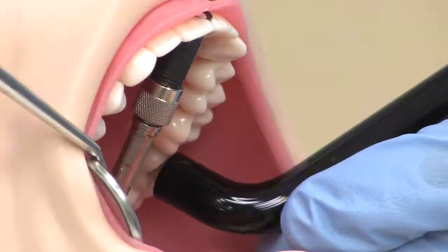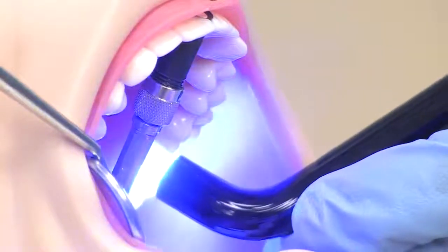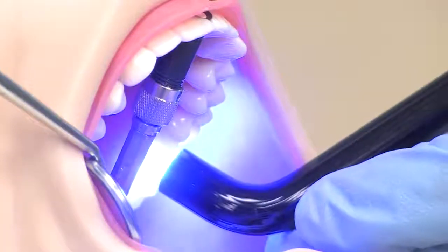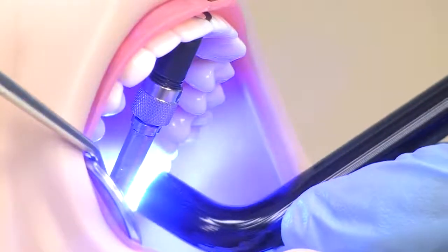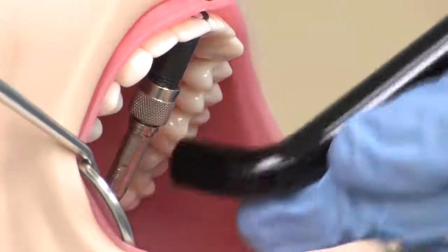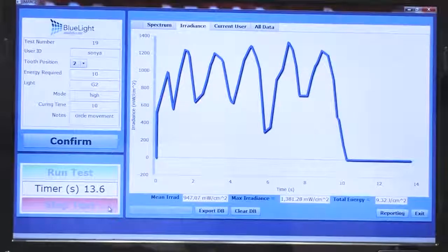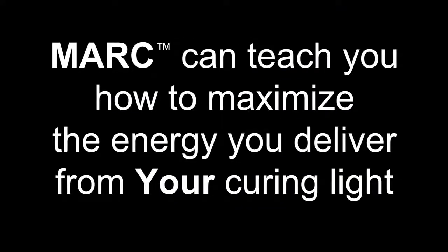Here you can see Mark being used to measure the amount of energy delivered to a simulated resin restoration during light curing. You will see the effect of moving the light guide on the amount of energy delivered. Mark can teach you how to maximize the amount of energy you deliver from your curing light to the resin restoration.